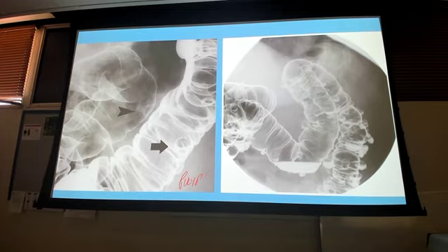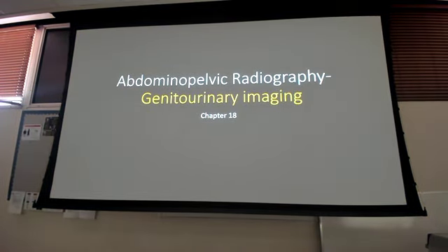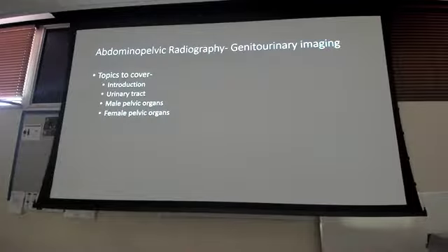Polyps, diverticuli. Inside, outside. Got it? See it? Magic? Questions on GI stuff on those organs? I said this one was pretty quick because it's just showing it to you again. We covered it already, but we were looking at it, just kind of rehashing it and adding a few things.